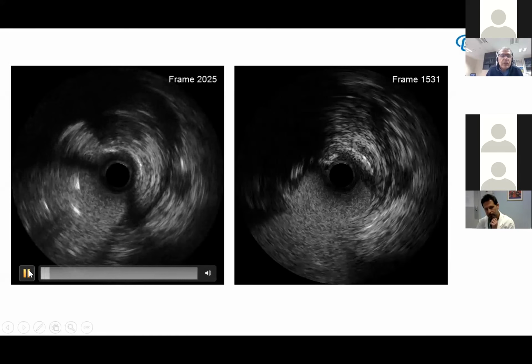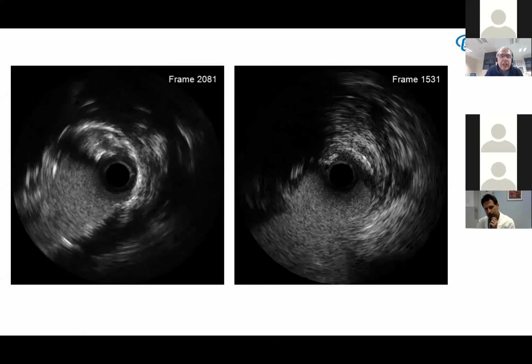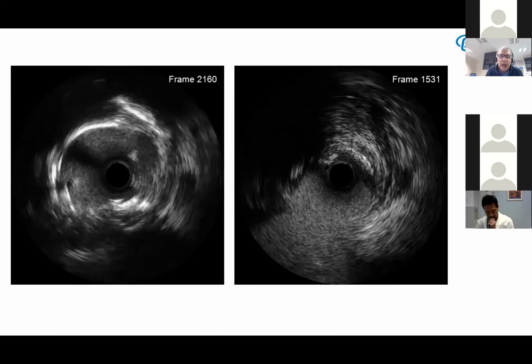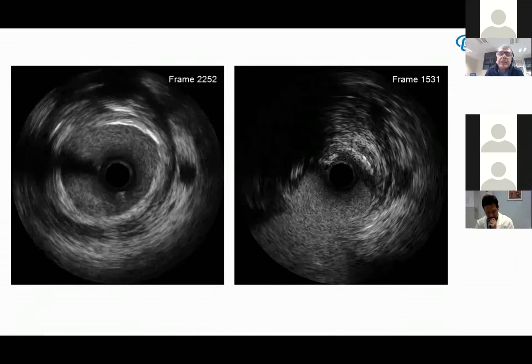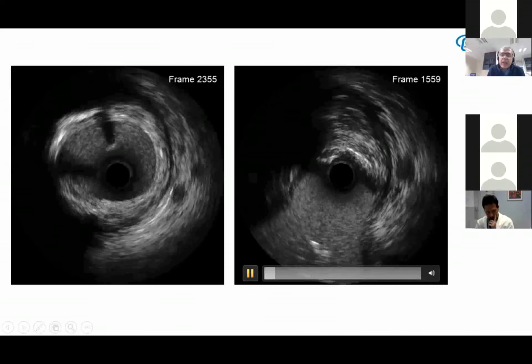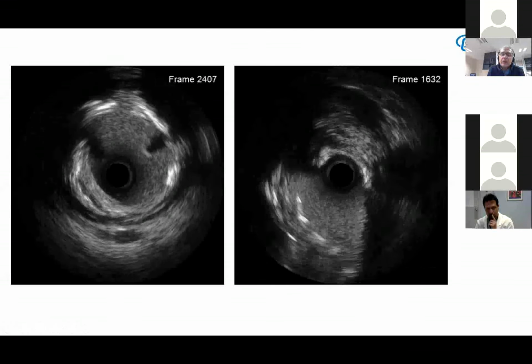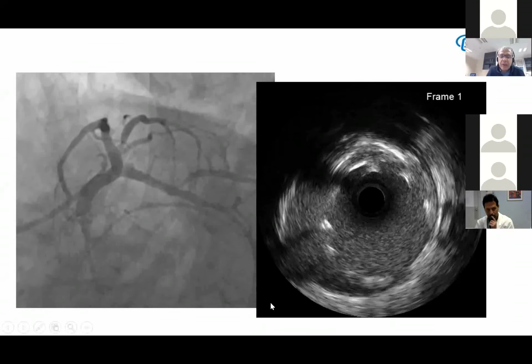but I show you the case with the IVUS. You see very well the cross, the stent is not completely apposed after crossing. This is the stent that I appreciate in the circ, and also after POT balloon. And this is the final result, but it's very important.